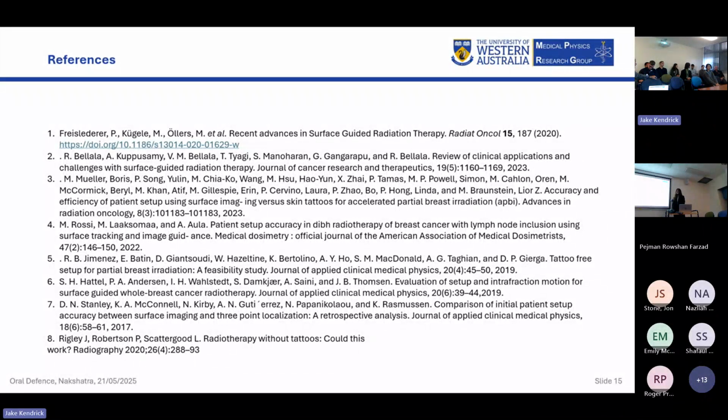When you're talking about the ground truth, are you talking about the 3D alignment of the anatomy underneath? Yeah, the target alignment, using X-ray images. It's used to compare because SGRT, as accurate as it is, is not completely reliable just on its own. We still need occasional IGRT as of now. So IGRT is used as a ground truth to compare how effective SGRT is.